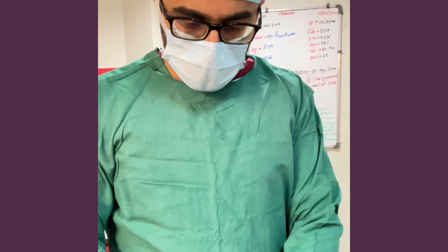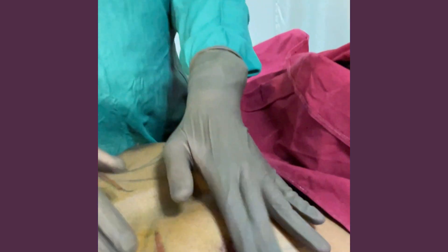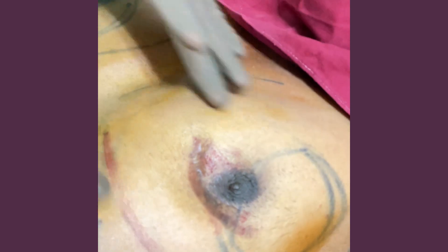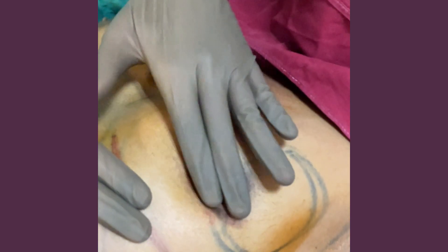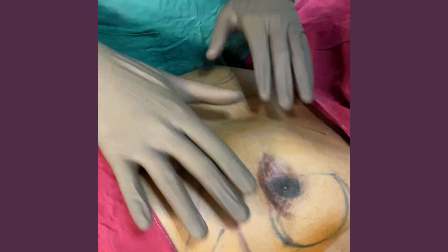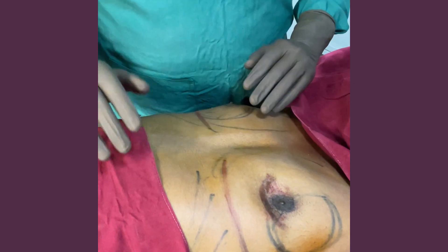Before starting, I want to show what we call a saucer deformity. This is what happens when you remove only the gland without liposuction — there is an emptiness here, what we call a saucer deformity. Today we are going to smooth it out and even it out. This side has also not been treated properly.